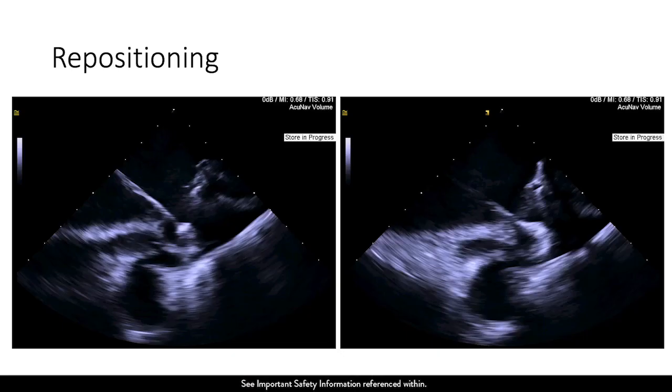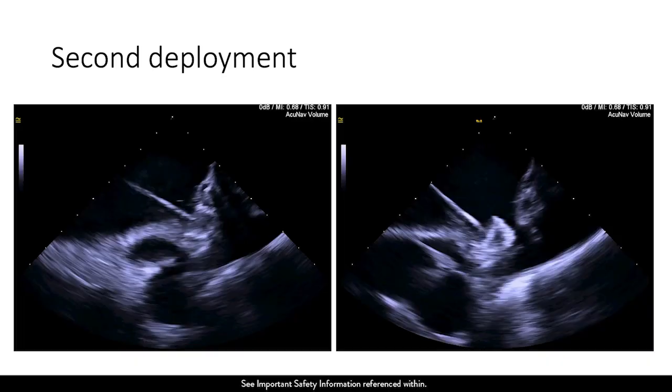You can see that this is why I think dual seal technology is very important, and I'm glad those questions come up because you really need to start thinking with the left side of the brain here. Now you have two options. You know that there is a gap on the top, right, towards the pulmonary vein side. So you have two options. You take this out and put a bigger device in, with a risk of stretching this in an 87-year-old, or you use your disc to cover the rest of it. So I want you guys to be the judge of that, how we utilize the disc in this case. People should be pretty sure and confident that this lobe is pretty anchored on at least one of the edges.